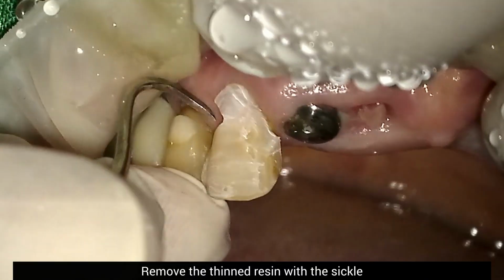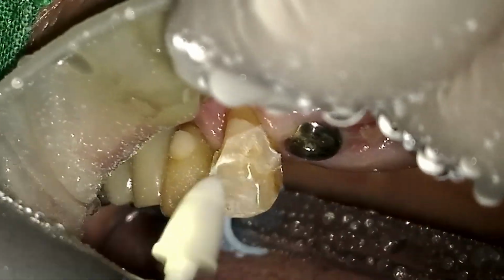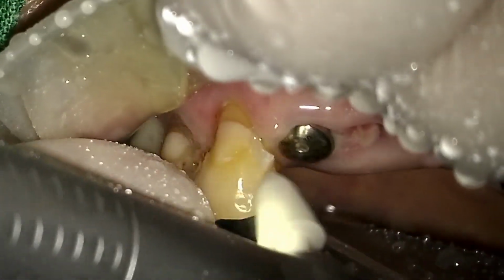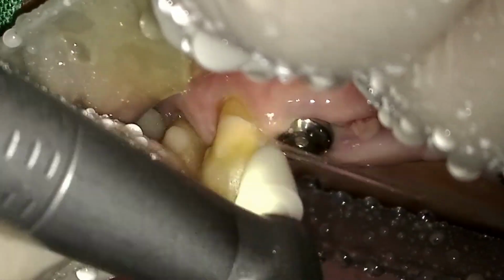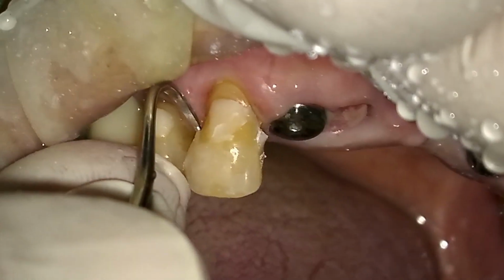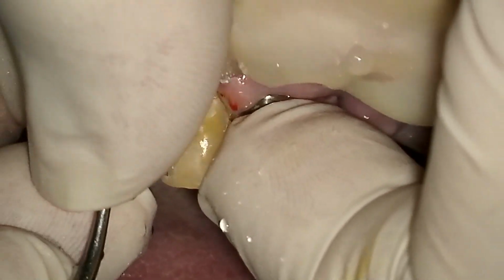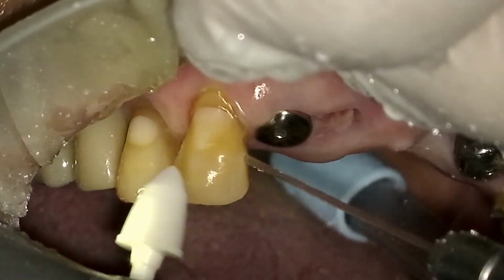Remove the thinned resin with the sickle. Use the silicone tool to further reduce the thickness. Scrape the thinned resin with the sickle. Repeat the same operation to finish.